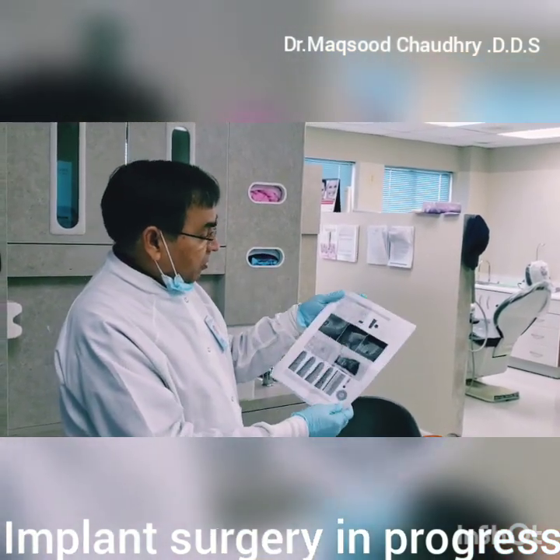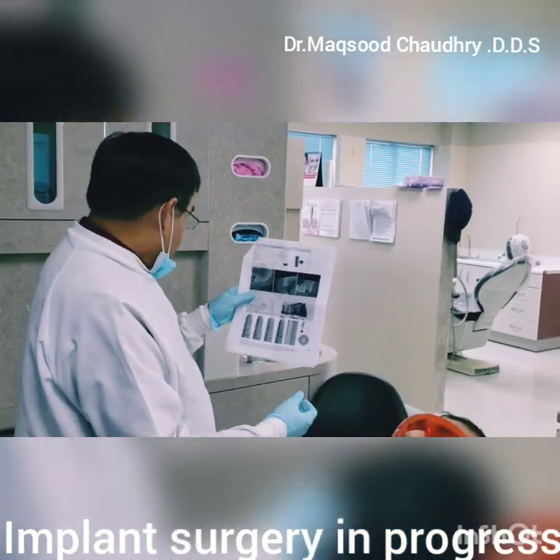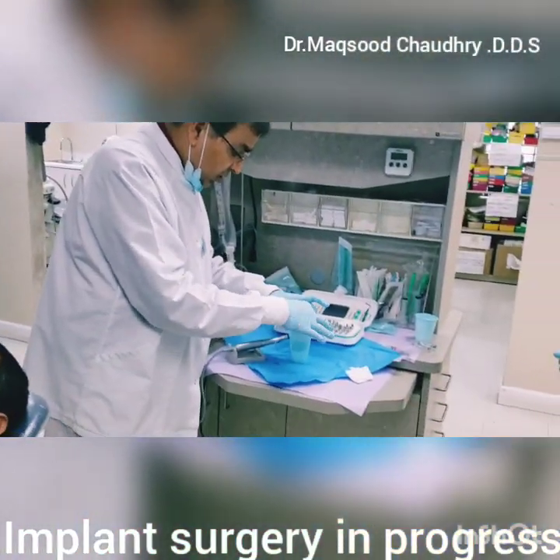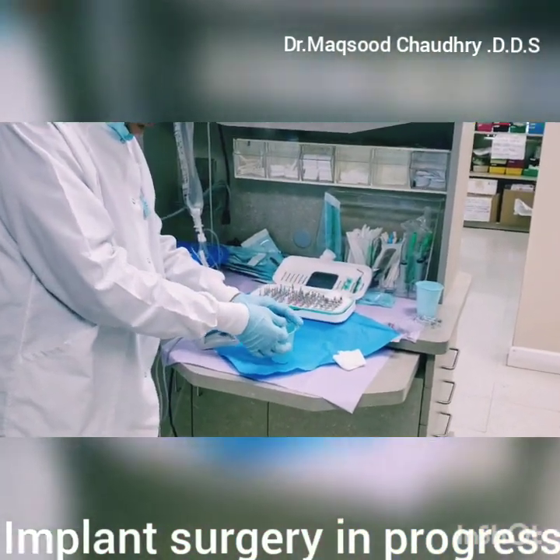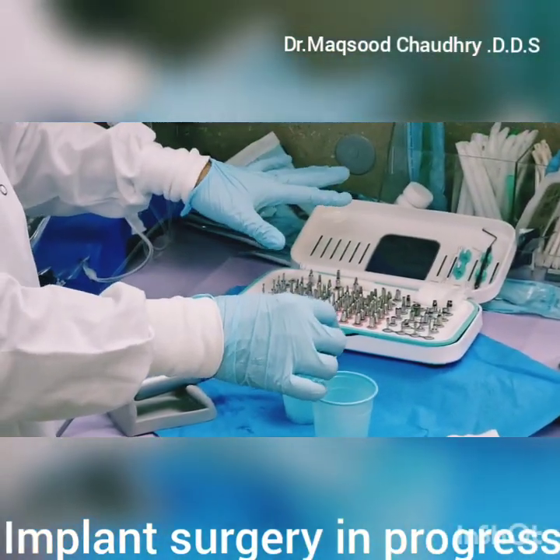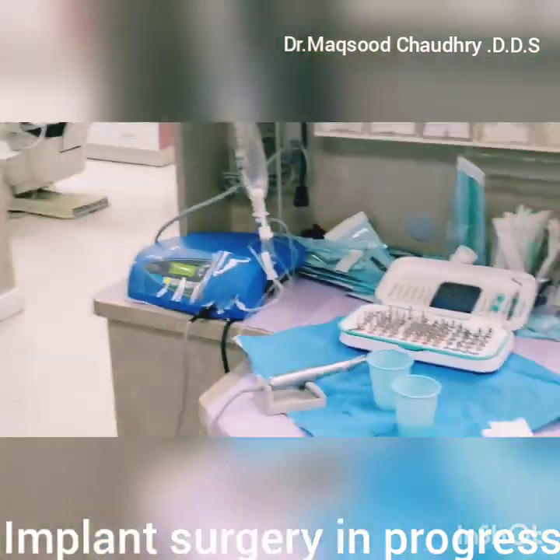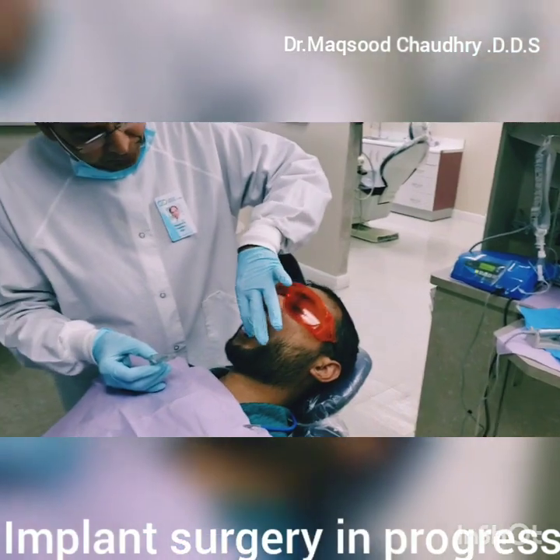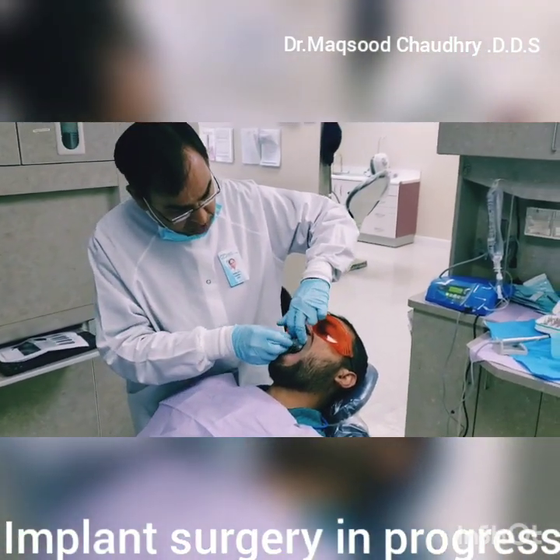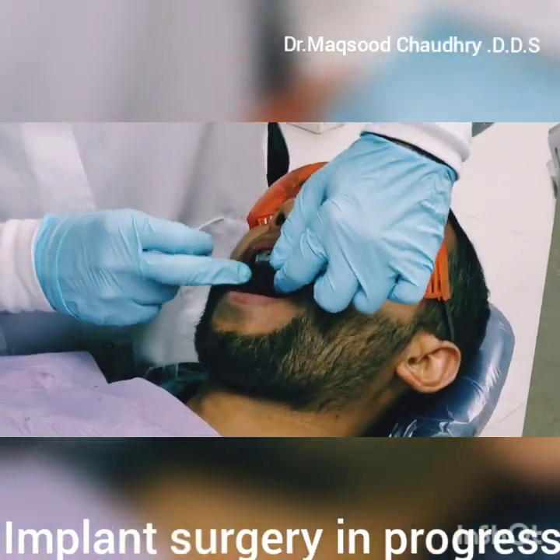All this is the report of our surgical plan before the surgery, and we prepare the surgical stent, which shows up in here. This is our surgical stent. This has been cleaned and disinfected with a disinfectant solution. This is our computer guided surgery kit. So I'm going to put this one in the patient's mouth. The patient was asked to rinse with the antiseptic solution, and after that we inserted this stent after anesthetizing the patient.